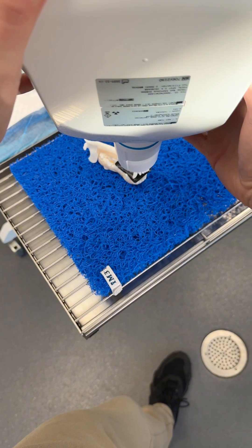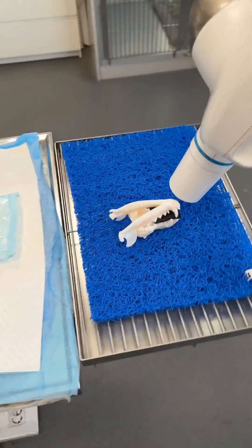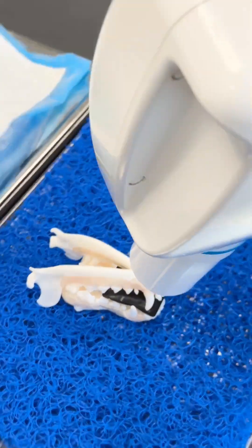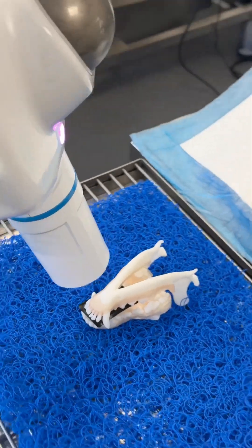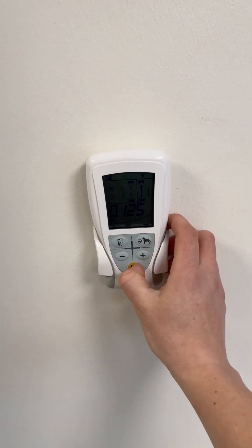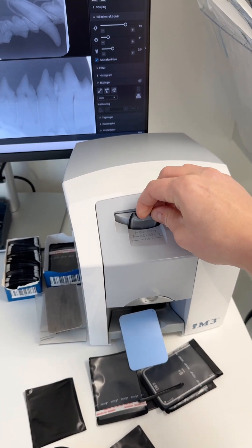You have to use a very steep angle to get the root onto the film. I'll show you here the exact placement. So let's try and take an x-ray and see what it looks like using this model.